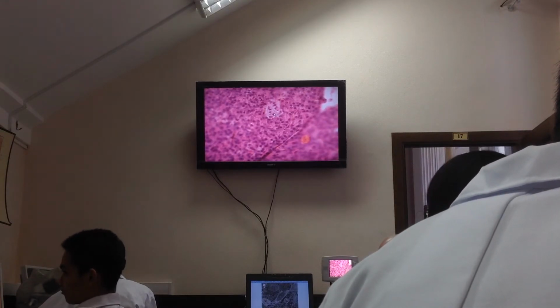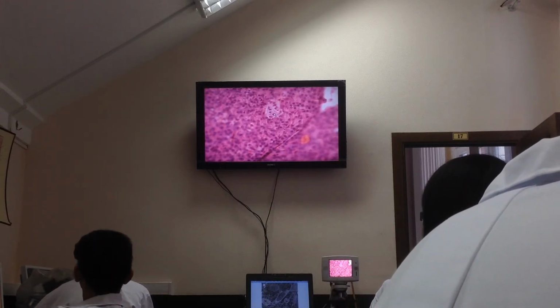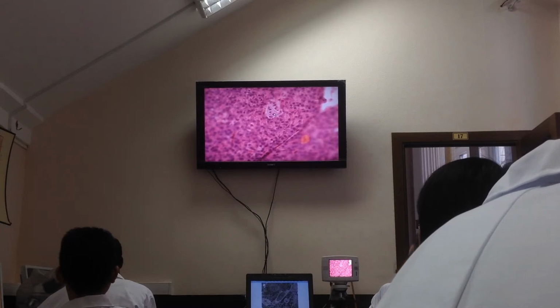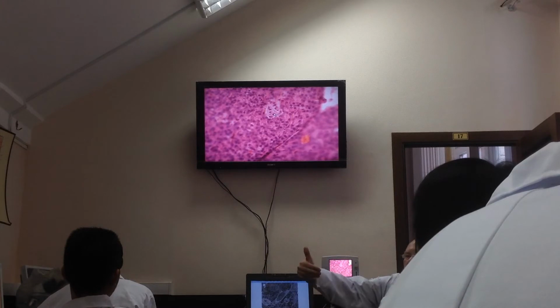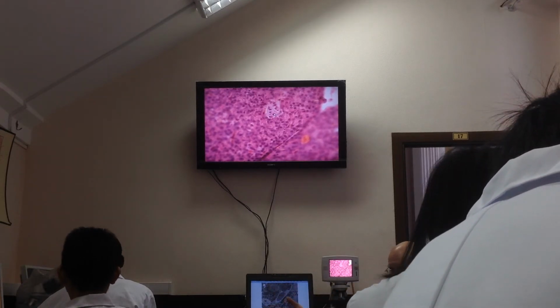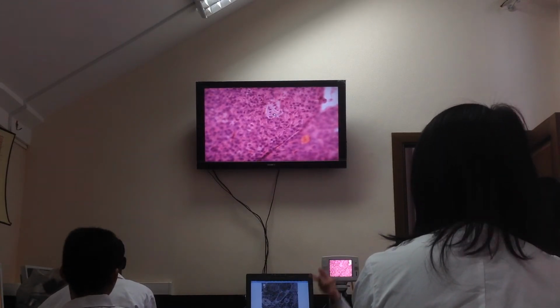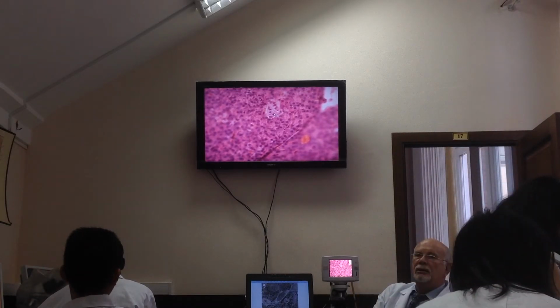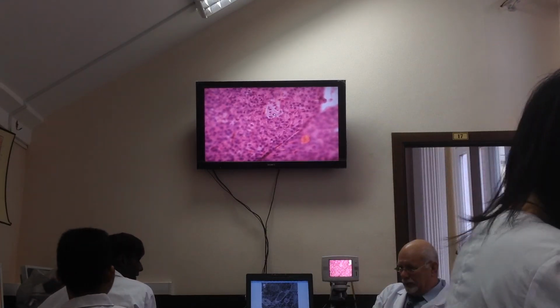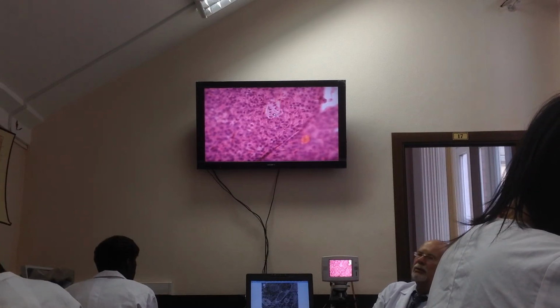You must find the islets in the slide, and then you must be ready to explain what cells are present in this islet, types of endocrinocytes, types of endocrine cells in the islets, hormones produced, biological effects, and target structures for hormones, as usual. Do you remember the endocrine system? Cell, hormone, effect, target. Clear? In these islets, what cells? A, B. A, we say sometimes alpha. B or beta. Then D. G. What else?